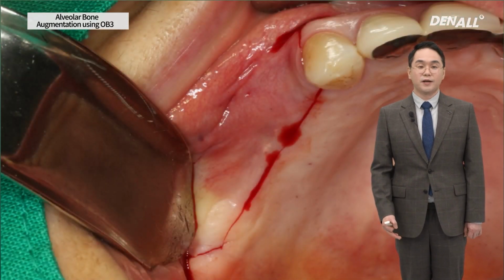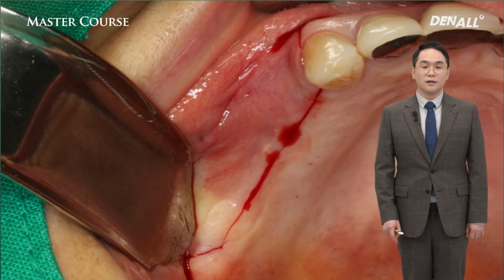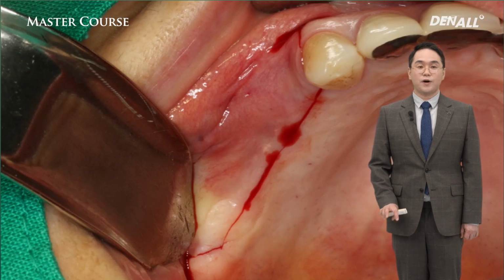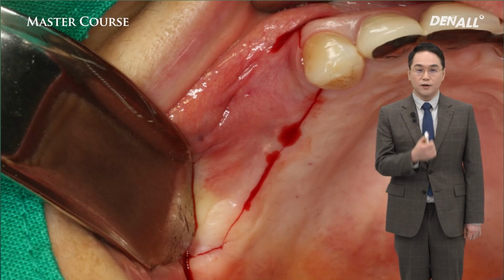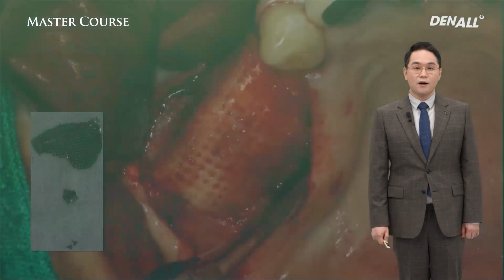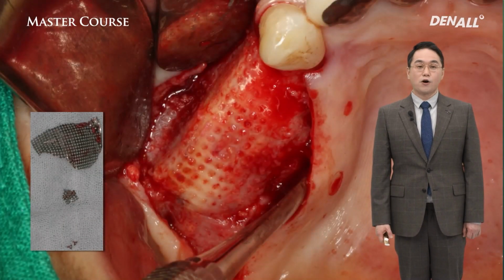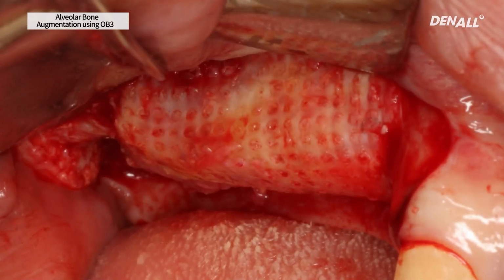Unlike the Jawbuilder removal, titanium mesh needs to be removed by making 2 large vertical incisions because the screw used to fix the titanium mesh is apically positioned, so the incisions should be made just like the first operation. The flap is dissected, 2 screws are removed, and the titanium mesh is removed. You can see bone is regenerated. In the lateral view, the titanium mesh is bent. The vertical and horizontal bone is augmented according to the contour of the mesh.